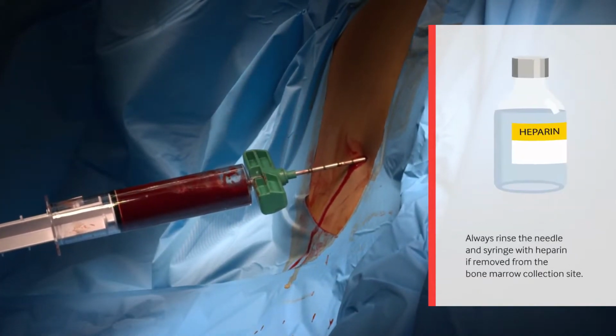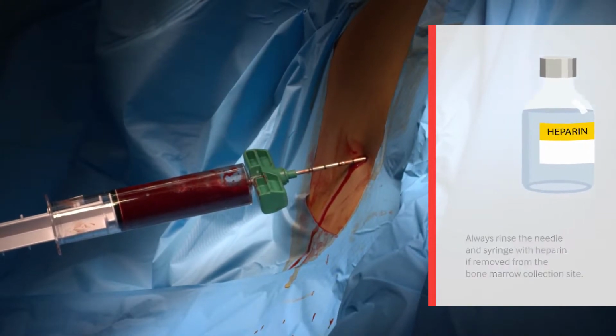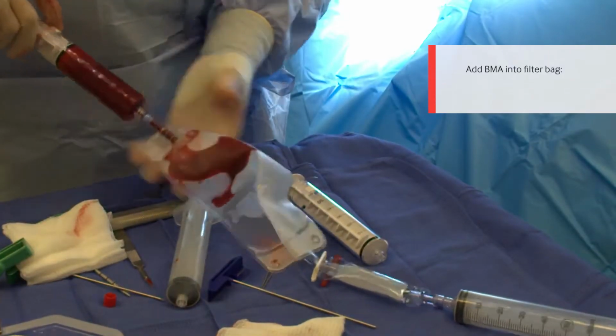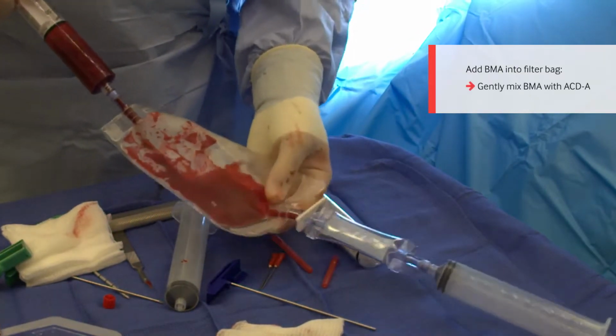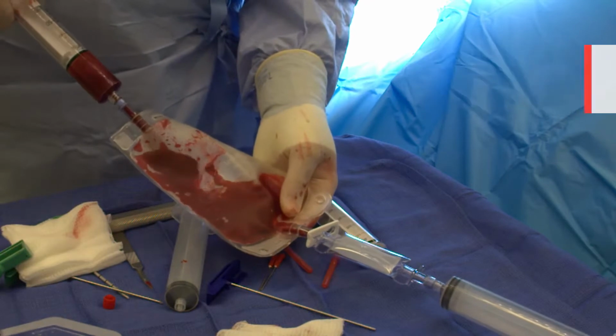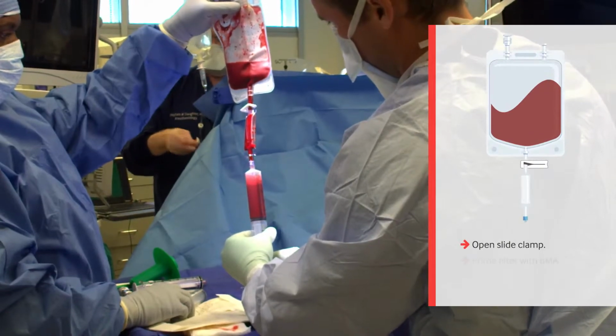If you remove any of the collection components from the bone marrow space, rinse them with heparin. Once bone marrow aspirate is removed, inject it into the filter bag. As it enters the bag, gently mix it. Once enough bone marrow aspirate is collected, it's time to process it.